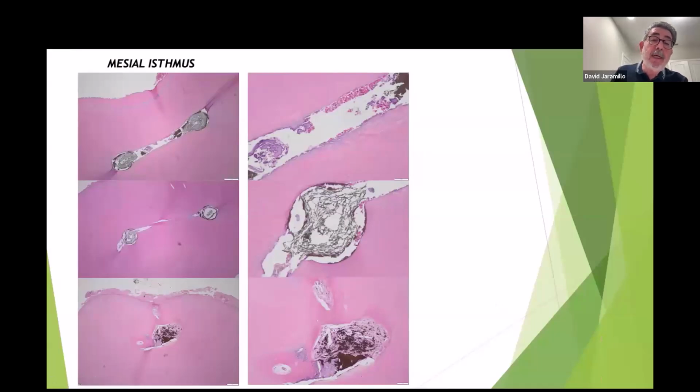This is another case that was treated with GentleWave. In this case, we can see some remnants of bleeding here. Some users claim that there's post-GentleWave, or post-PIPS, or post-SWEEPS bleeding.